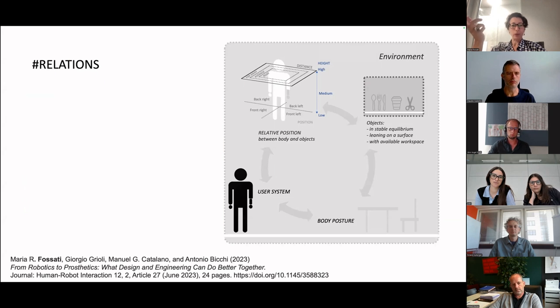Another great opportunity is to highlight also the relation between the user system and all the environment. This means that in all the tasks we saw, we had to also consider the body posture, for example, or the relative position of the object with the user, and also the conditions of the objects. So where is the object and so on.